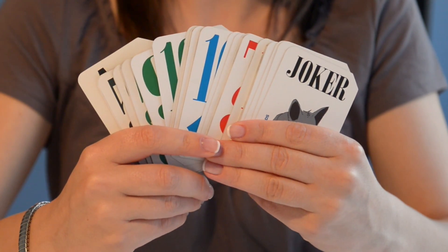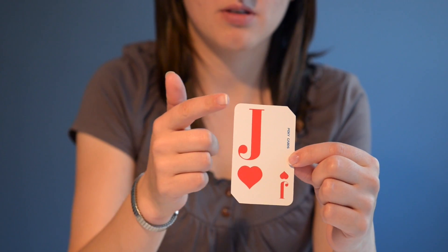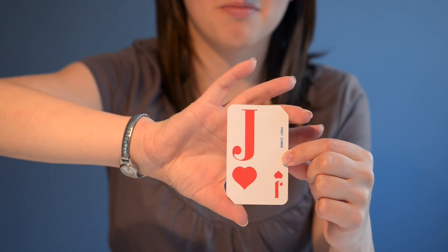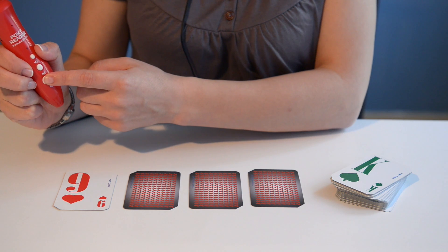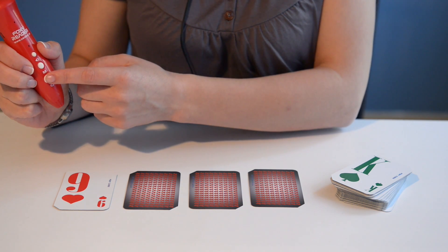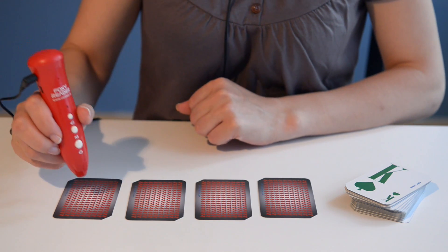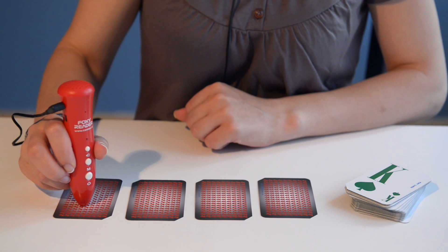The large letters help visually impaired people to read the cards easier, and the two diagonally opposite corners are cut off to allow easy handling. When you play in groups, you get private information about the cards over earphones. Just connect the Foxy Reader with the card and it will reveal which card you are holding.